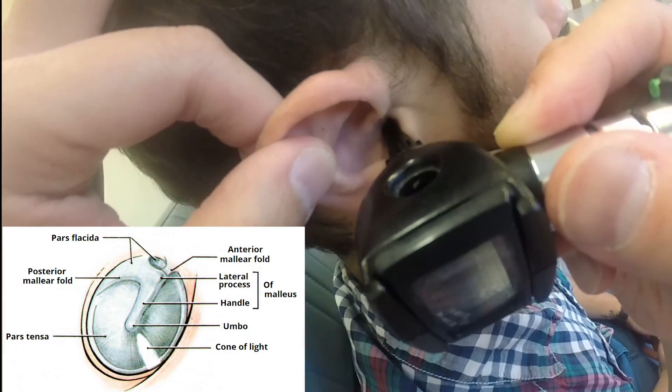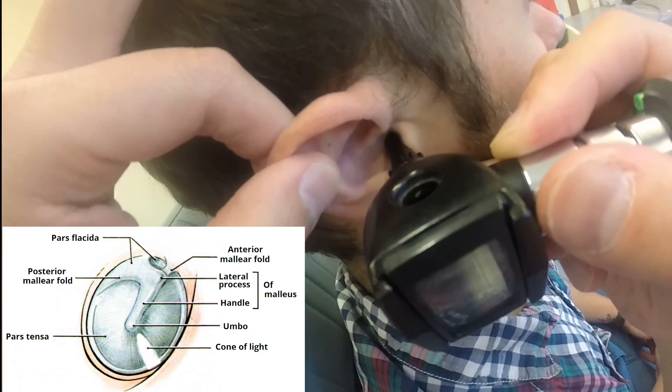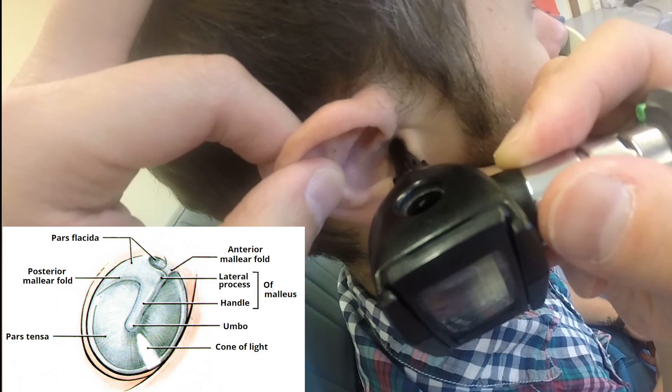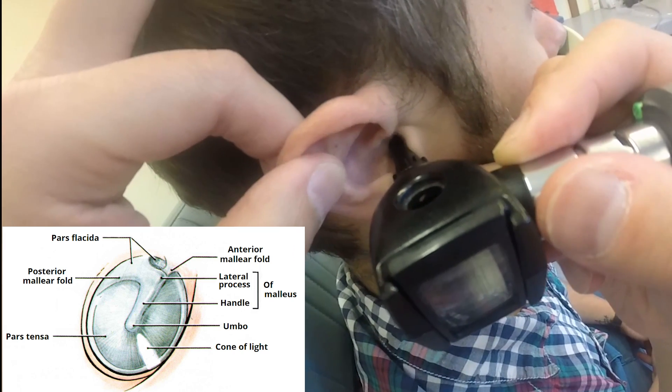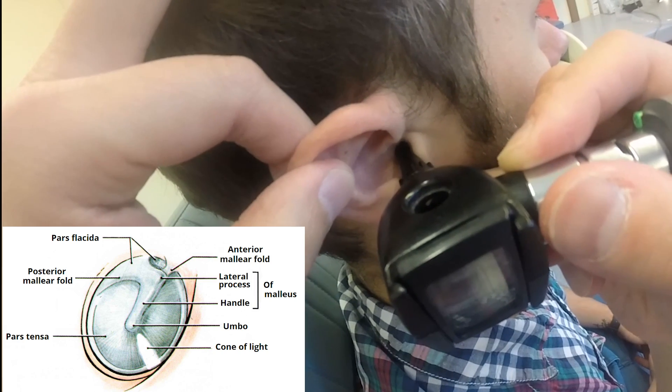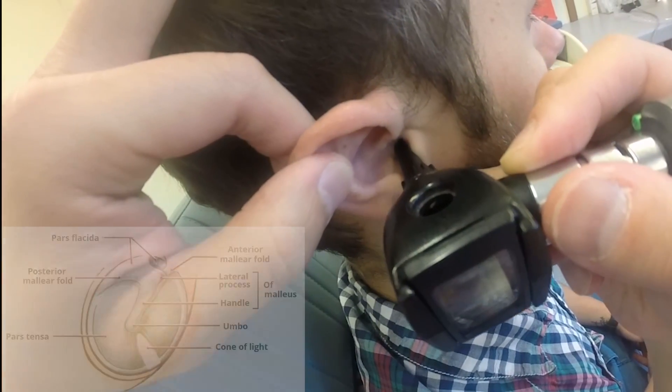The first thing that you should look for would be the umbo and then the handle of the malleus. And if it's a normal eardrum you should be able to see the light reflex, or the cone of light, in the antero-inferior part of a normal eardrum.